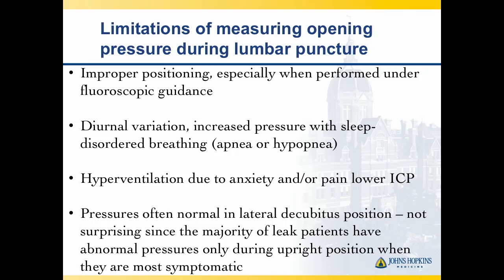If you hyperventilate, you cause hypocarbia. It can falsely lower your ICP. And as everyone has heard time and again, pressures are often normal in the lateral decubitus position, but that's not surprising. Patients are not symptomatic in the lateral decubitus position. They're symptomatic when they're upright. So you need to know what pressures are in the upright position in this group of patients.